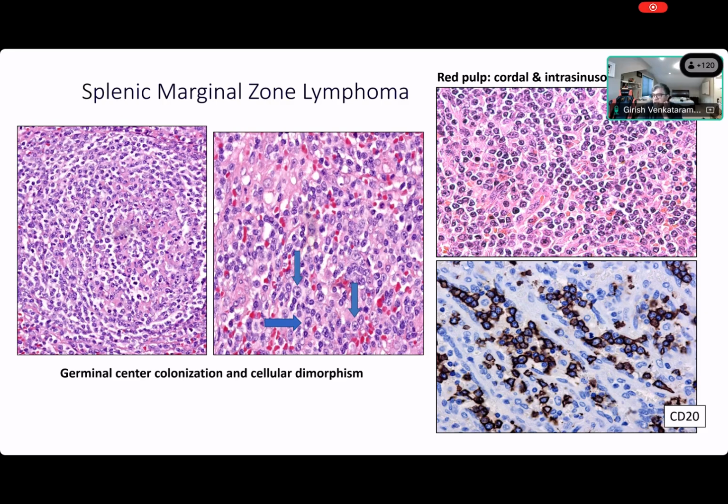And at the bottom right, you have a lot of CD20 positive cells in what looks like an Indian file pattern. When CD20 looks like this, you immediately think of a marginal zone lymphoma with sinusoidal involvement. So patterns help a lot in these diseases. We don't need to use any fancy stains. Between 5 stains, you have 90% of all lymphomas that can be diagnosed, right?